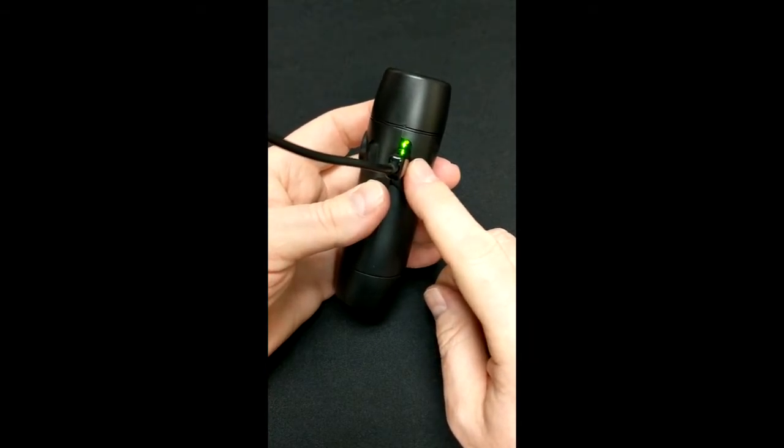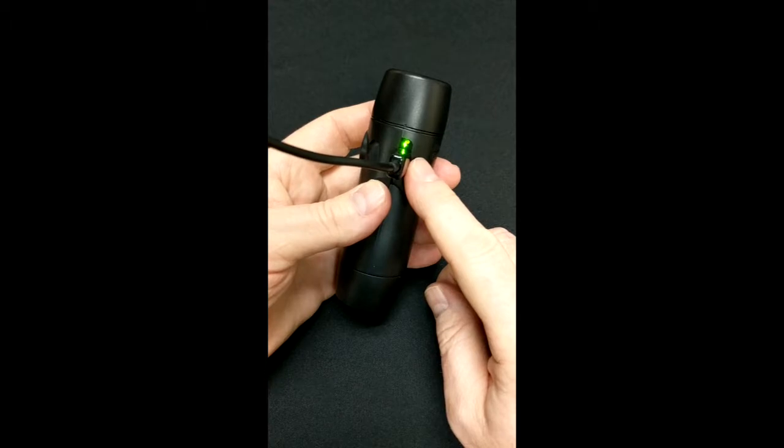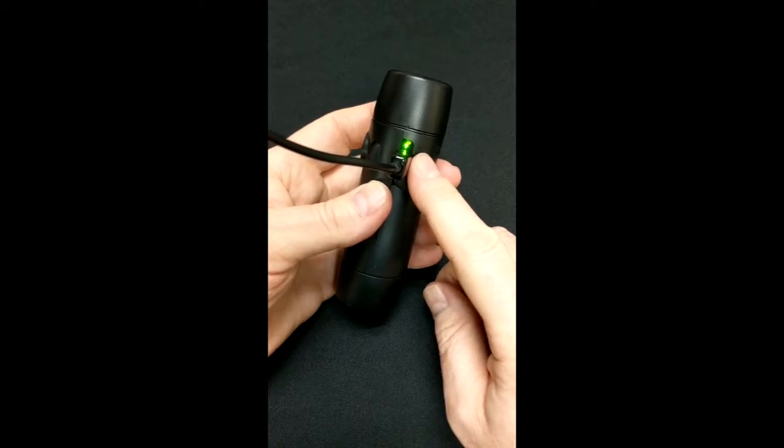When it's fully charged, which takes about 5 hours on a fully dead battery, the LED starts to blink.